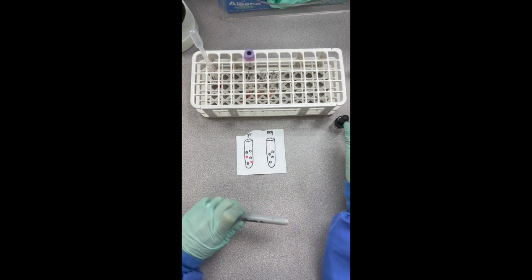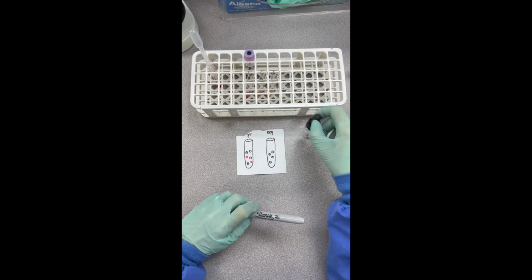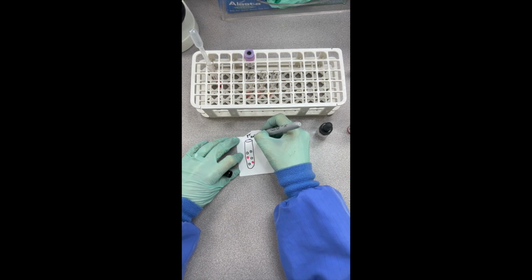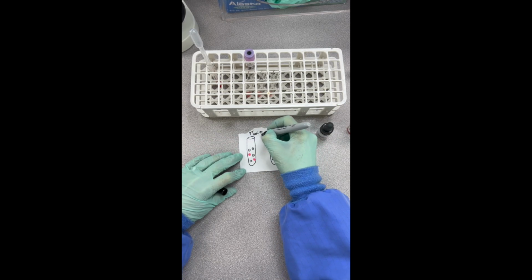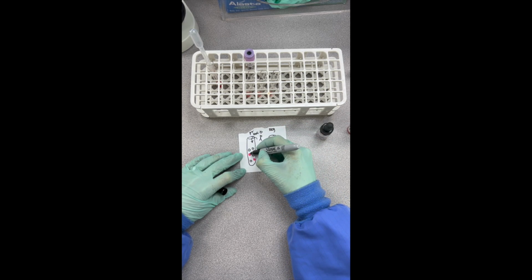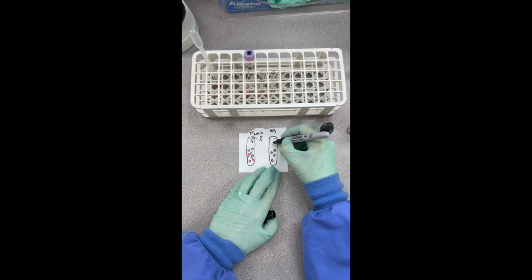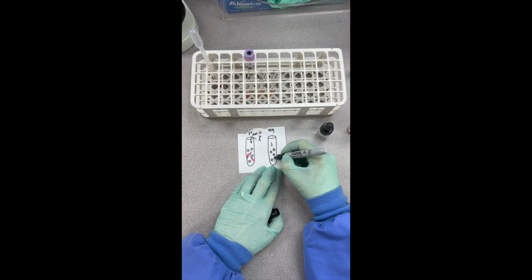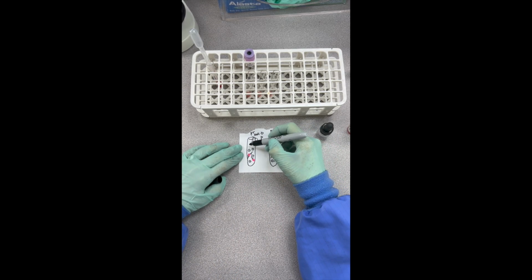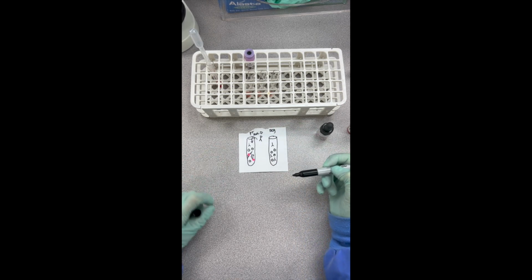And what we've done, we've added, remember this anti-D, this is anti-D, so it's antibodies to D, right? So this is how I usually draw that. Got a little D on there, so we're going to put that in there, right? And it is going to attach to these D cells, right? See those? And we're going to add it over here, but there's no Rh positive cells for it to attach to. See them in there? And these aren't going to attach to mom cells because those are Rh negative.